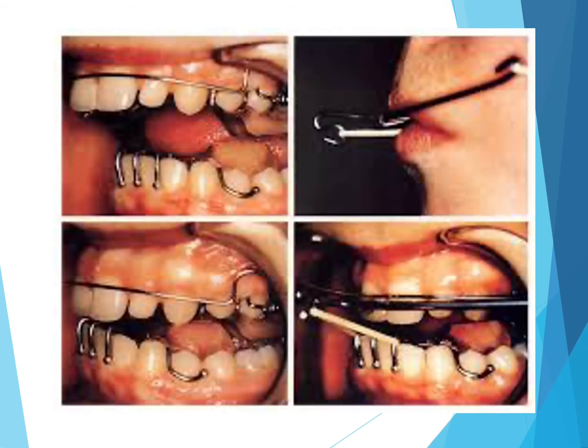This photo shows the patient wearing the twin block intraorally, attached with the Concord face bow as extraoral traction. The Concord face bow is connected through the upper maxillary molar. On the upper plate of the twin block, there is an Adams clasp at the upper maxillary molar. A headgear tube is attached to the bridge of the Adams clasp of the maxillary molar, and the Concord face bow is connected to the upper plate of the twin block by attaching through this headgear tube.